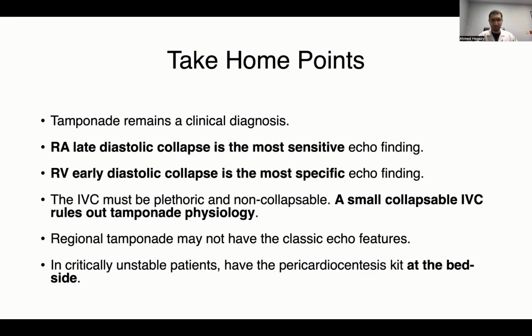In critically unstable patients with large pericardial effusions and tamponade physiology, you should call cardiology to drain it because they are the experts in pericardiocentesis. However, you should always have the pericardiocentesis kit at the bedside just in case this patient crashes.